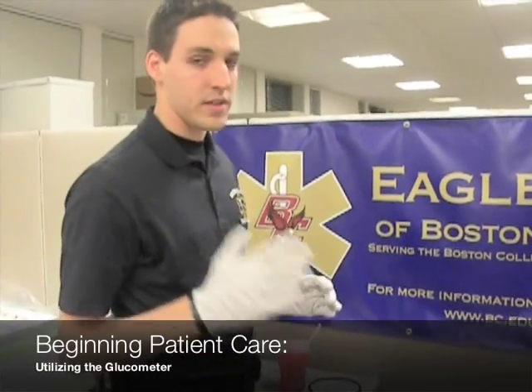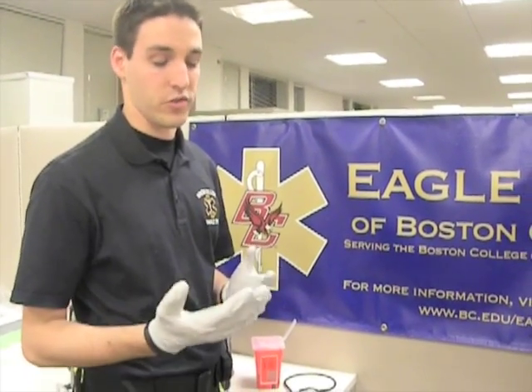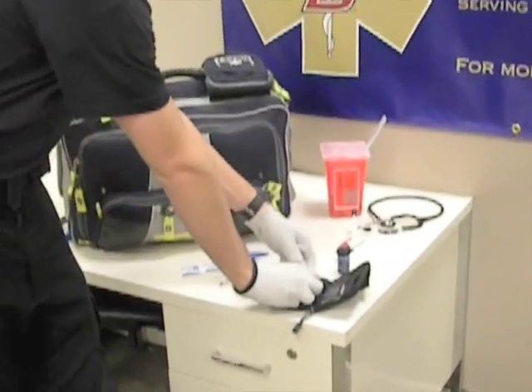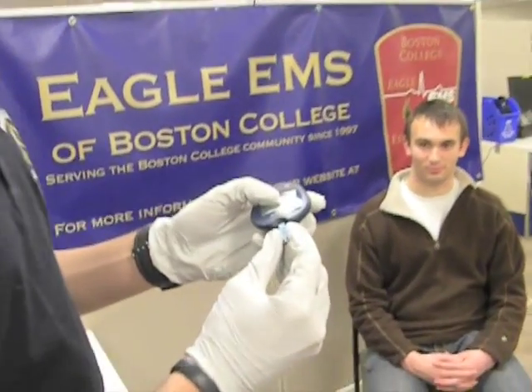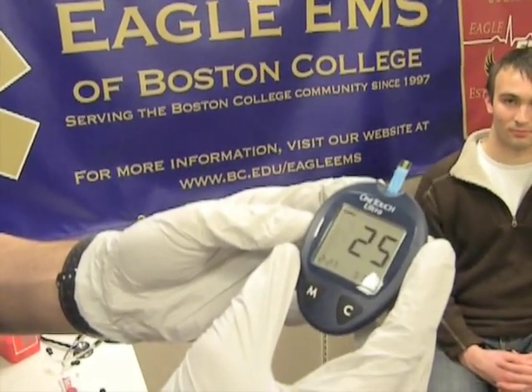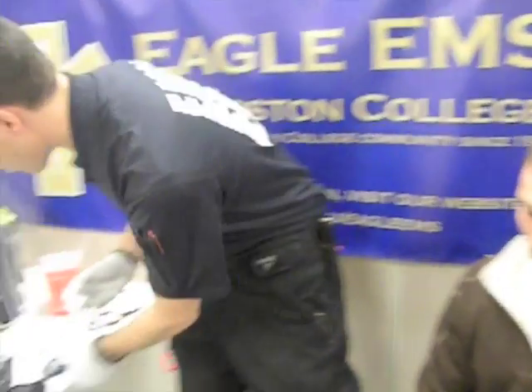So the first step, as always, is safety and BSI — make sure your gloves are on. We're going to be dealing with blood here, so you want to make sure that you protect yourself first. Then the first step in this whole process is to turn on your glucometer. All you have to do is take your test strip and insert it into the machine, and it'll turn on for us. After you've done that, you want to make sure that you sanitize the area properly so that there's no risk of infection.